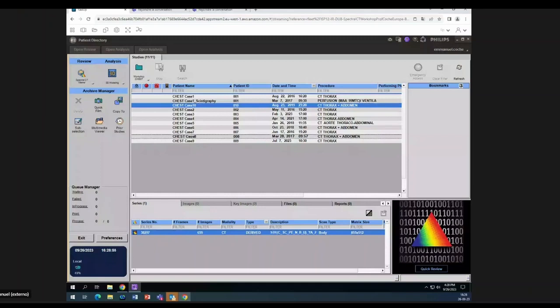There is another one. I would like to ask Professor Koch this time about the iodine uptake. We have in Spain so many customers that have read your Spectral book and use it as a true guidance, but they are struggling with the threshold of the uptake. Some customers start to think that it is a captation of structure when the iodine density is above 1.5 milligram per milliliter. So we would like to know, what do you think about it, and if the threshold is not closer to the values of 0.7 or 0.9 of iodine concentration to talk about true opacification.